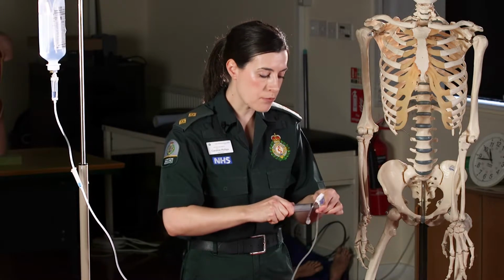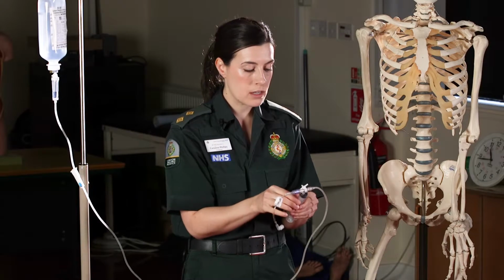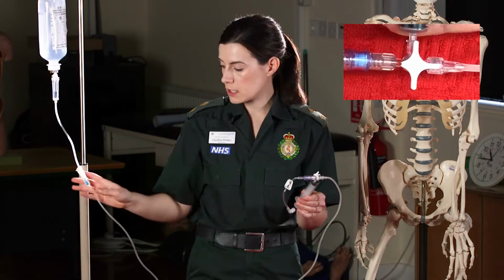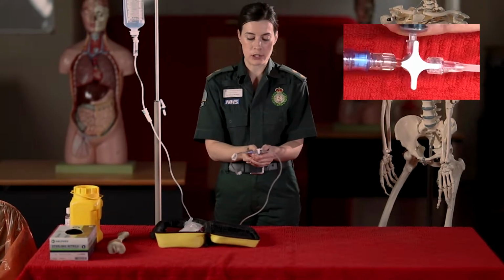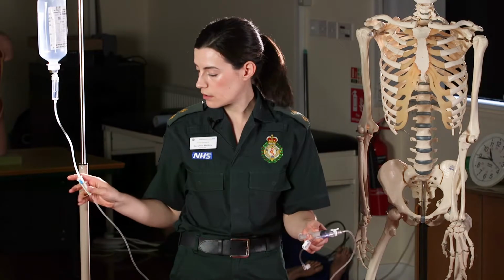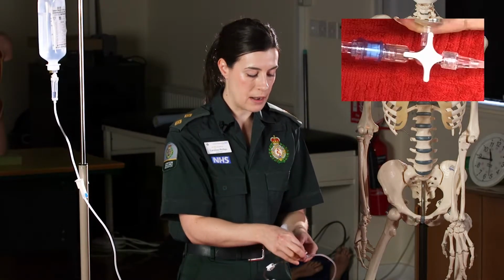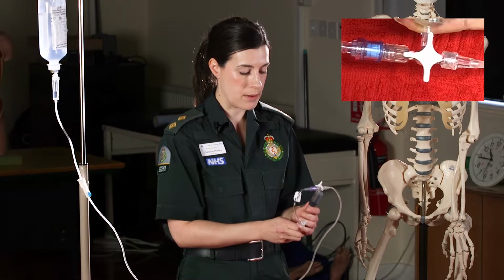It's very important that I prime my right angle connector to make sure that there's no air within the tubing. In order to do that, I'm initially going to turn the port of the EasyIO off to the right angle connector, turn my fluids on, and draw up some fluid into my syringe. I can then direct my 3-way tap around to the angle connector and prime that with fluid.